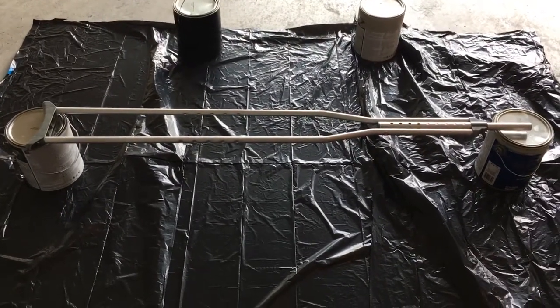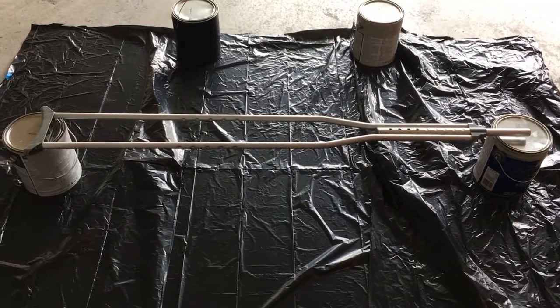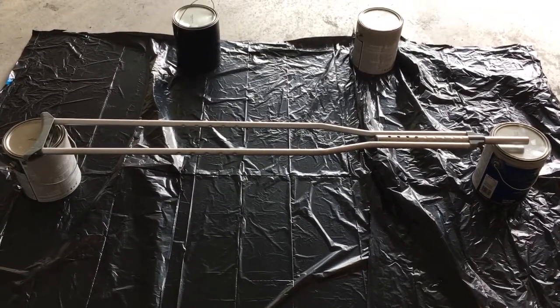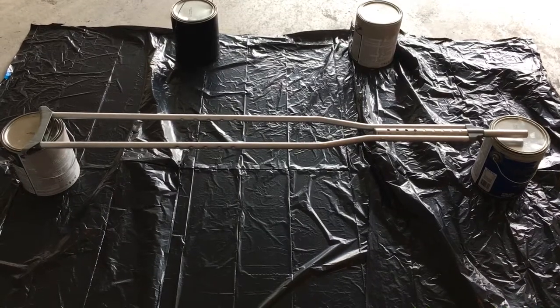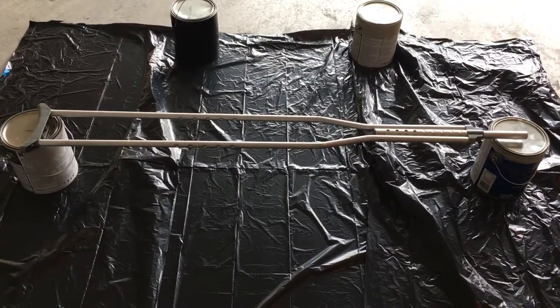Because the weather's crappy outside, I'm actually going to do this in the garage, with the door open to give myself some ventilation. I'm going to go ahead and give it a shot — this is what it looks like before. I'll probably end up doing a couple of coats to see how everything goes.